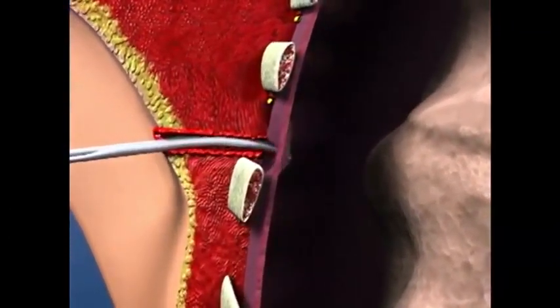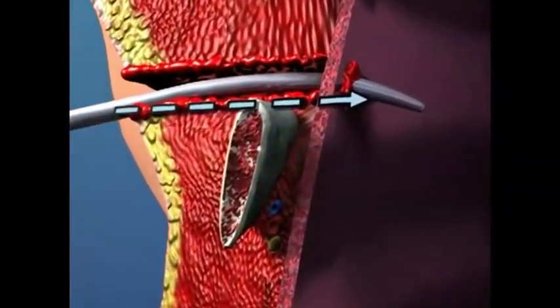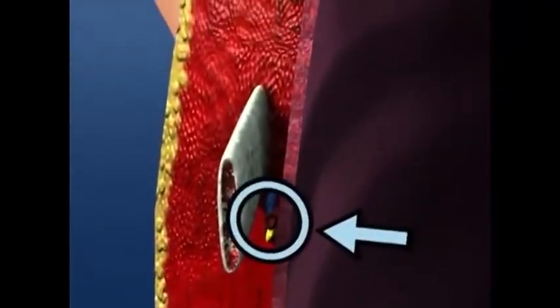With the tip of the hemostat, puncture the parietal pleura while pushing just at the top border of the rib. You must always enter the pleural space over the top of the rib to avoid damaging the neurovascular bundle that lies along the groove at the inferior border of each rib.